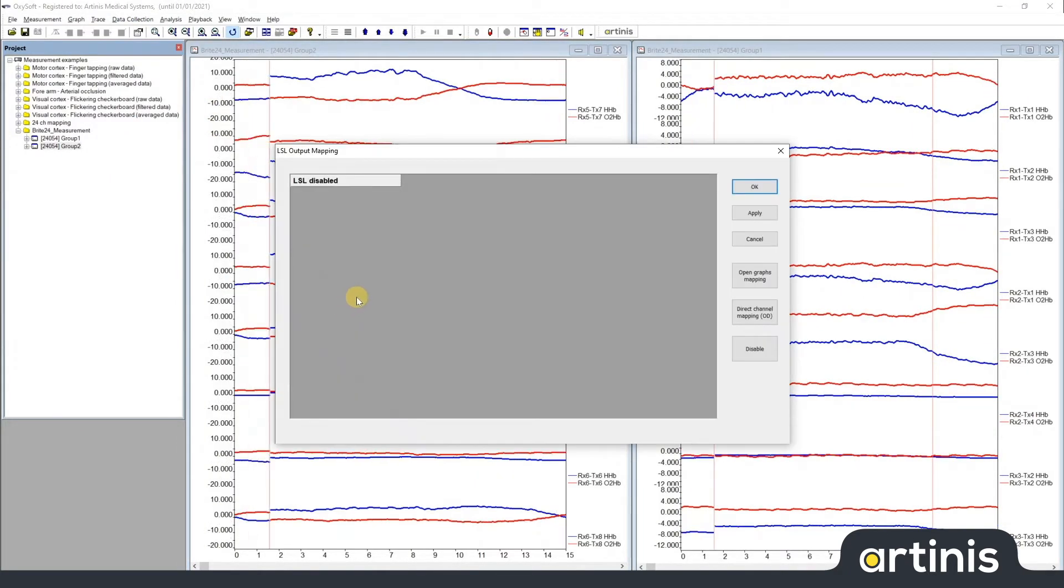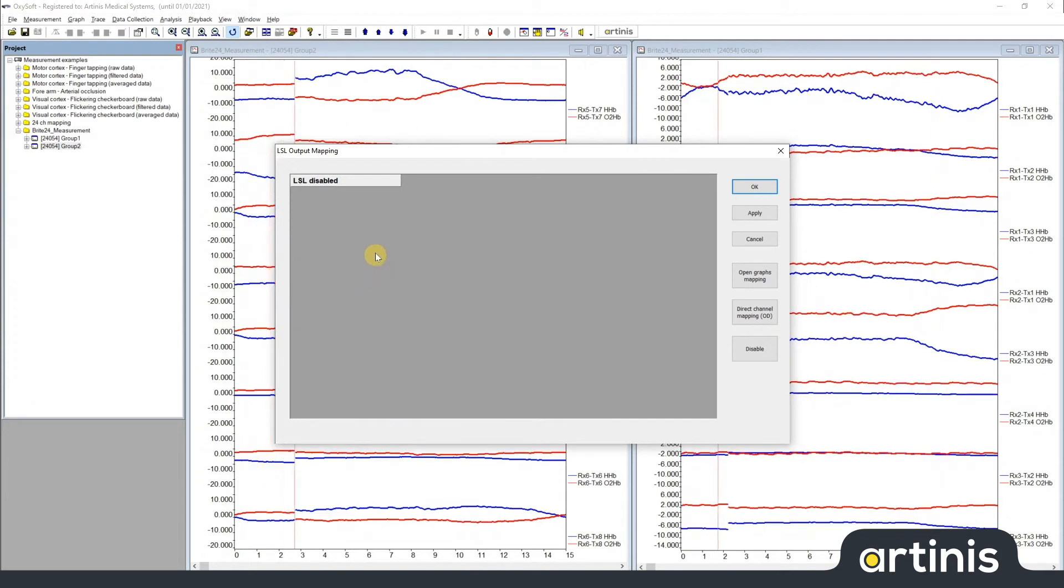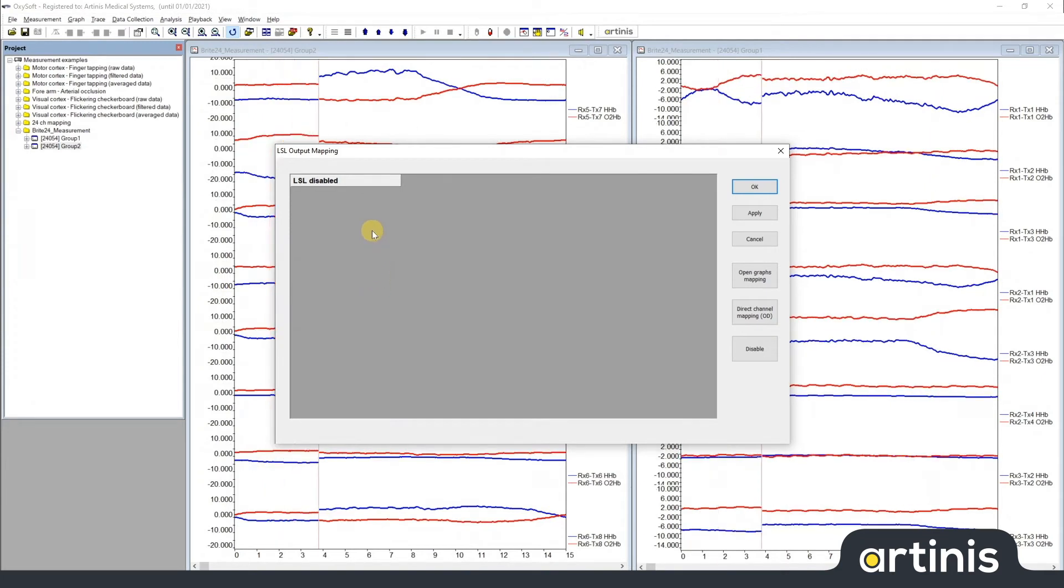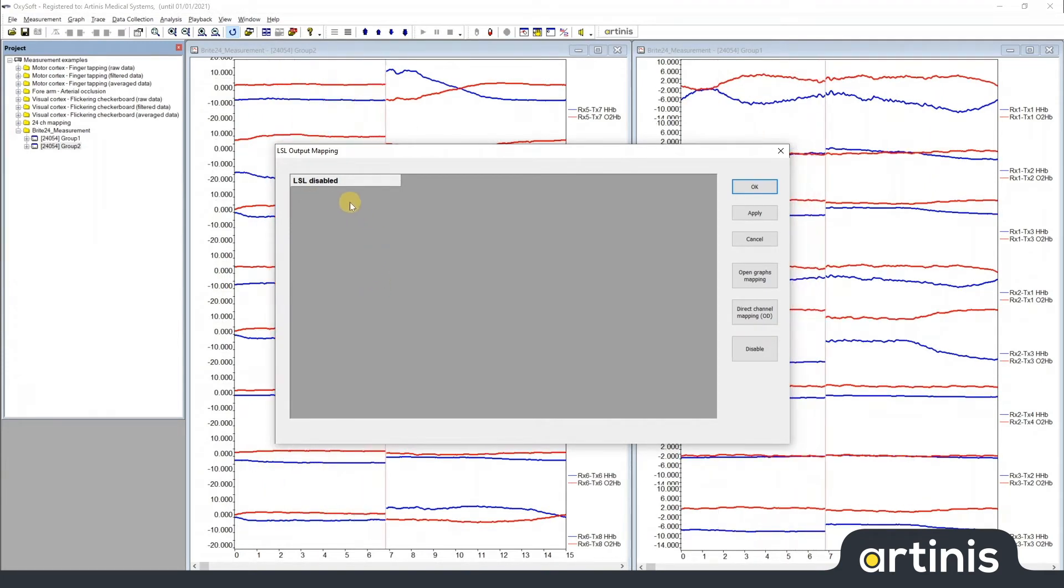This brings us to the LSL output mapping window. As you can see, LSL is disabled by default.